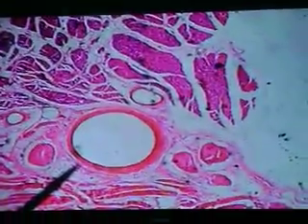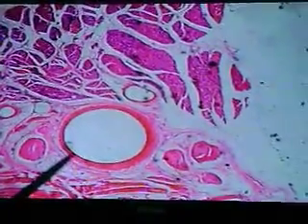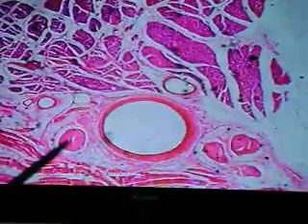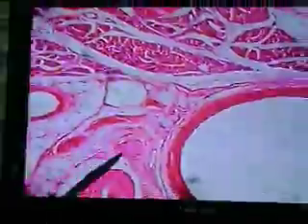So whenever I want to look for an artery, I always pick up the slide of the tongue, and it shouldn't disappoint you. So there, this seems to be the lingual artery. That's one of the major arteries, and there we can see a number of nerves going with the lingual artery right here, and we suspect this to be, for example, one or some of the terminal branches of the hypoglossal nerve, maybe traveling with the tongue. So these are a number of nerves right here in cross section. Okay, and there we can see smaller vessels, smaller arteries.